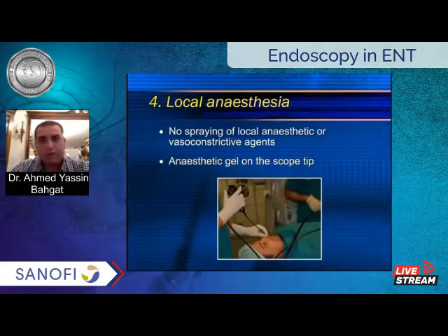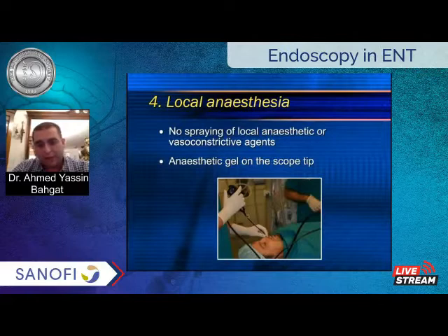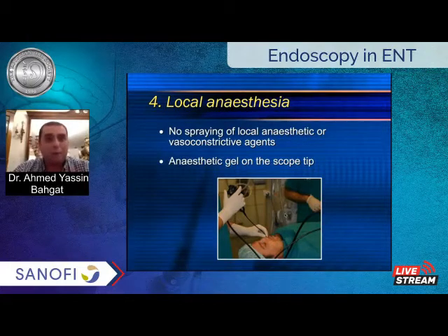We don't give any local anesthetic. Sometimes you can put local anesthetic on the scope itself, like xylocaine gel, but don't put local anesthetic in the airway because it irritates the patient and keeps him awake by the bad sensation in his throat.